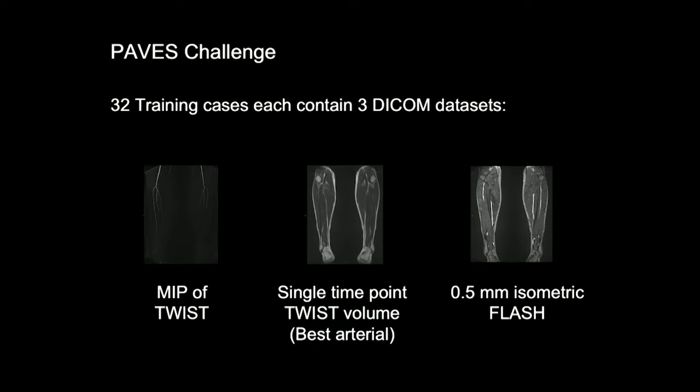They were also given some instructions and details about the anatomy of the arteries and veins, and a little bit of information about DICOM and the potential for using a subtraction method to use the arterial only set from the twist to potentially subtract that away from the high resolution images to do some volume matching. And that was the challenge that we posed, and there was a lot of interest, but I think a huge number of the participants found it too difficult without a labelled ground truth.